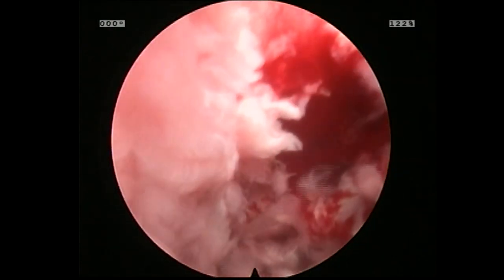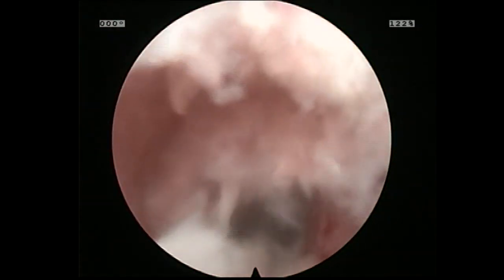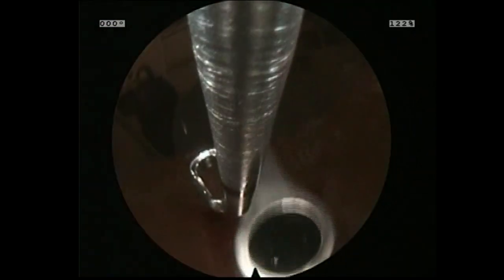Here is an endoscopic view of the disc space after what I thought was an adequate disc prep — obviously not good enough. Here I am endoscopically removing some loose disc fragments, but you'll notice there's still not enough disc material been removed for adequate end plate prep, or what I would consider to be adequate.